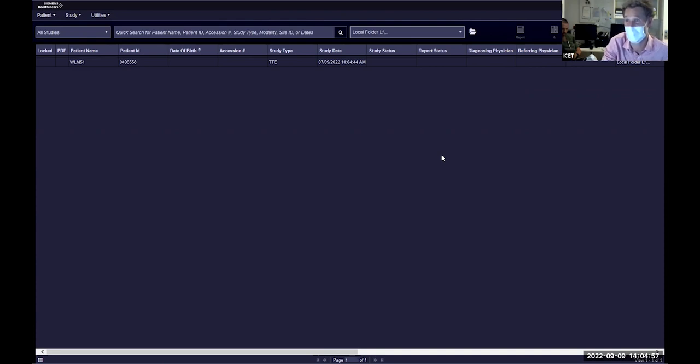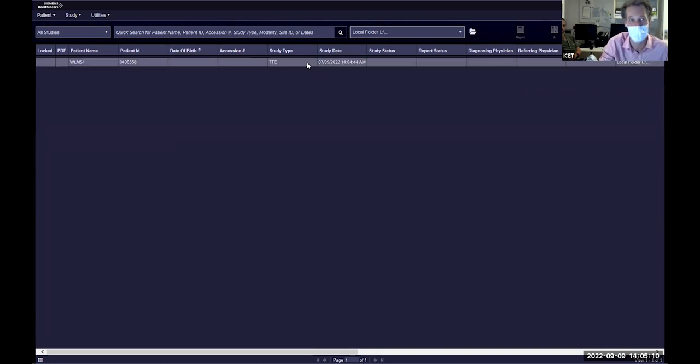We're going to just go through a bunch of cases if you guys are up for that. These are a collection of cases from a few years ago that a friend brought up, to ones from the last month or two around the Echo Lab. We'll start simply and work our way up.